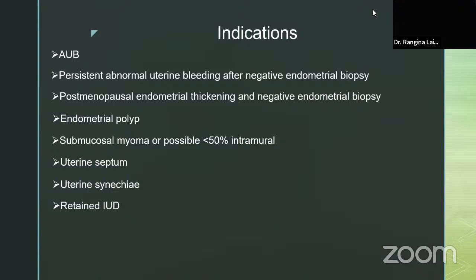In spite of that, apart from retained IUD, I would like to focus on retained fetal bones. I don't know about the scenario in India, but in Nepal, to have a male child is a priority, and it's a must for most families, even educated families. In my career, I have seen more than 10 cases of patients who had a second trimester abortion with retained fetal bones, and we removed those retained fetal femur bones, skull, even scapula through hysteroscopic guidance.